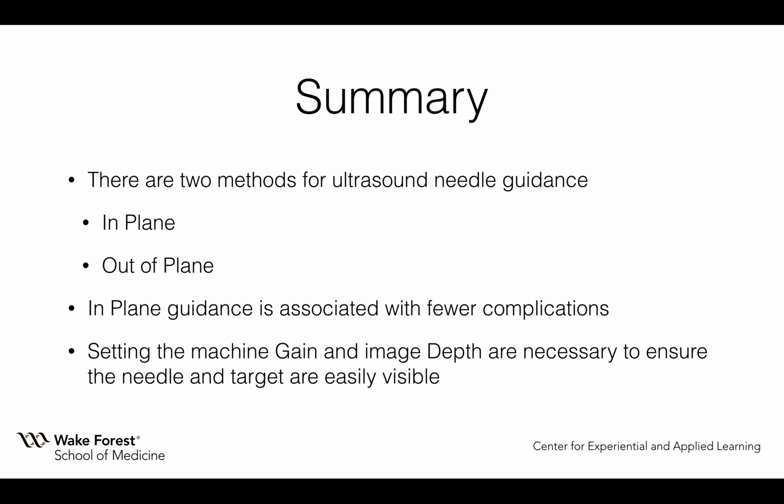So to sum it up briefly, it's important to know there are two different methods for guiding the needle during ultrasound guided procedures, in-plane and out-of-plane. Overall, in-plane guidance is associated with fewer complications because we can be sure that we'll see the needle through the whole tissue path of the needle.